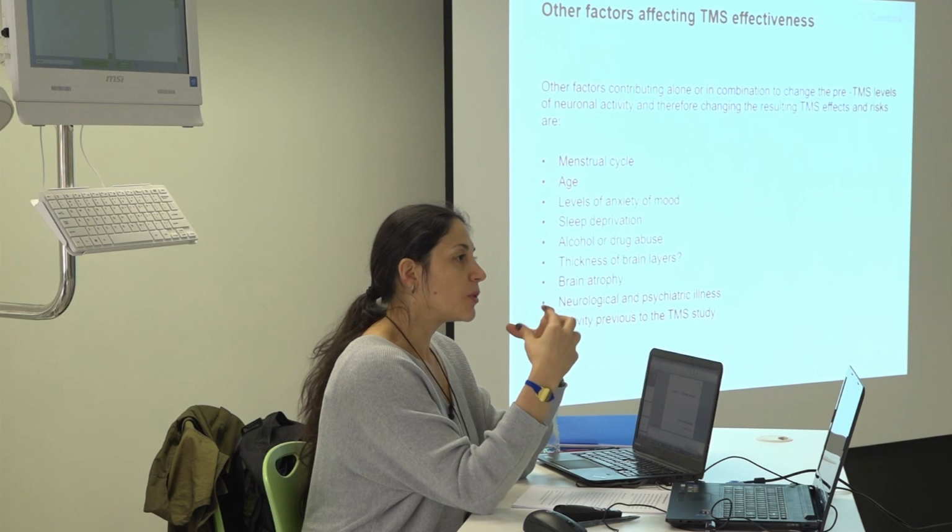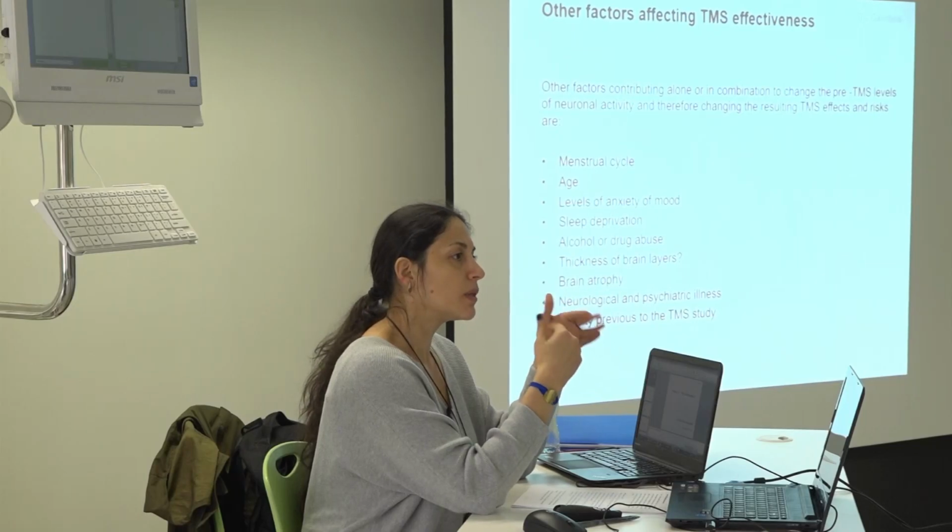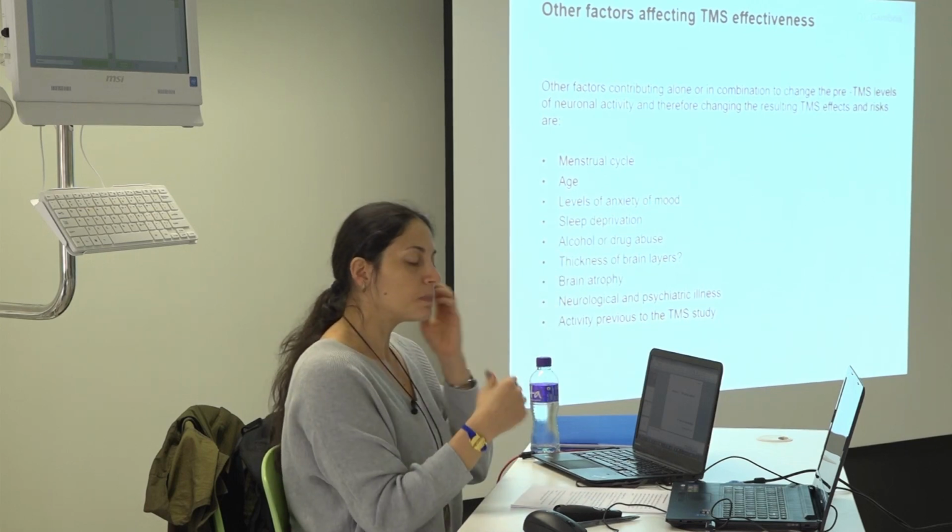There are many changes in the brain. You are measuring excitability, it will interact with TMS, and you will not have a proper measurement of what is really happening. So in Germany, I never did TMS over menstruating females, and it was stated in my ethics and in the consent form. But in the United States, they don't care so much about it.